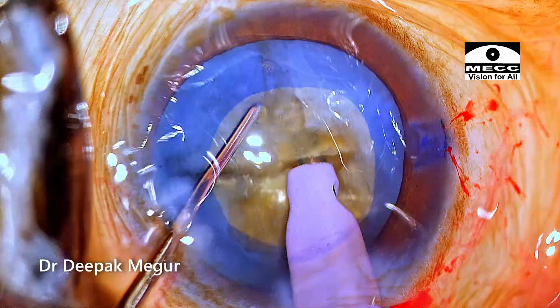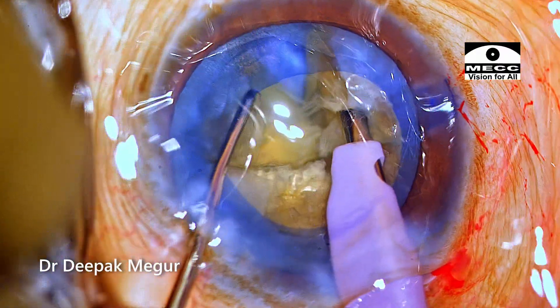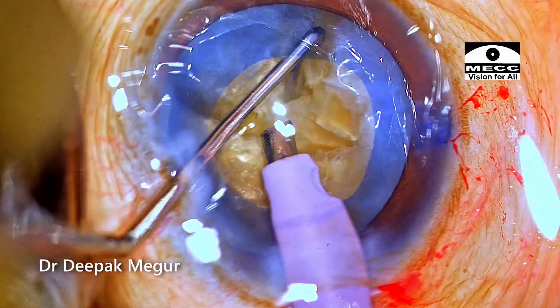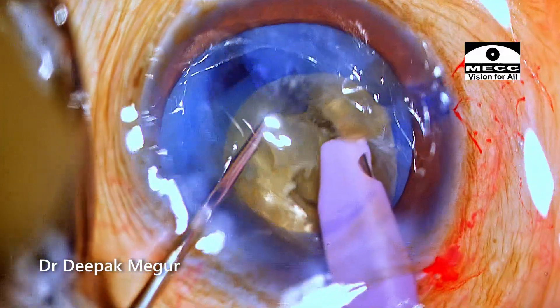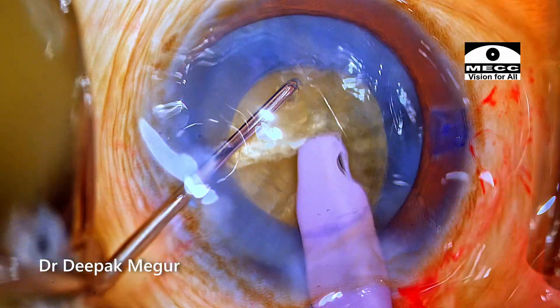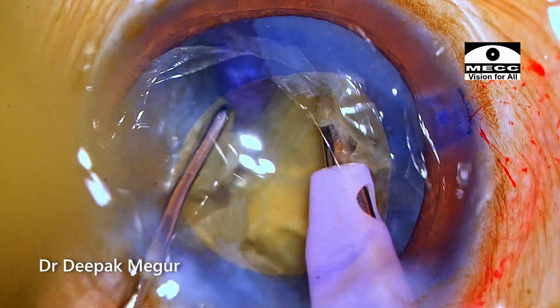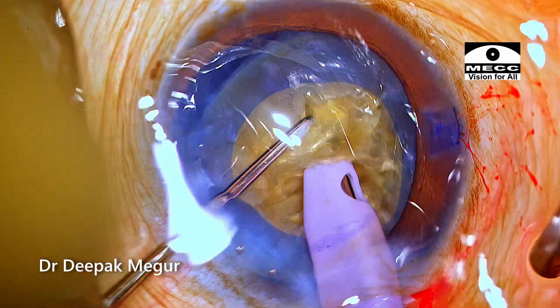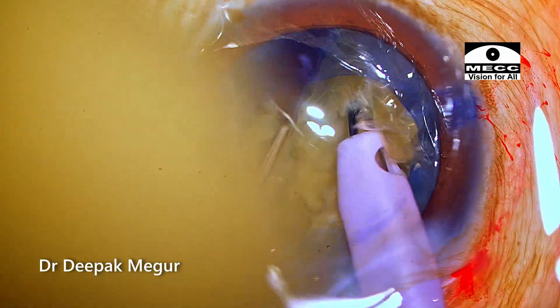Time for the second chop. This time, the tip is buried sufficiently deep enough and the chop is initiated. It requires at least two to three subsequent attempts of lateral separation by placing the chopper at a deeper plane to achieve a full-thickness crack of the posterior plate. During all these maneuvers, the rhexis margin was not stretched. The nucleus division process continues following the same principles. There is one moment where there is a slight tug at the rhexis margin during lateral separation, but other than this, most of the lateral separation maneuvers did not induce any pressure or tug at the rhexis margin.